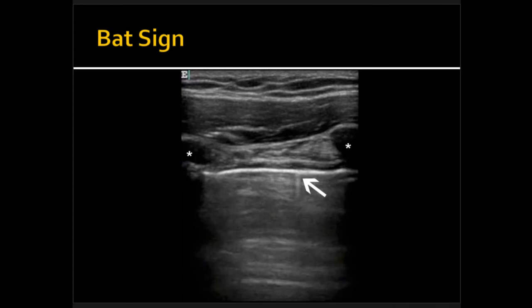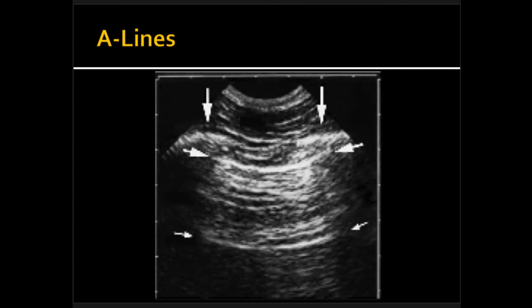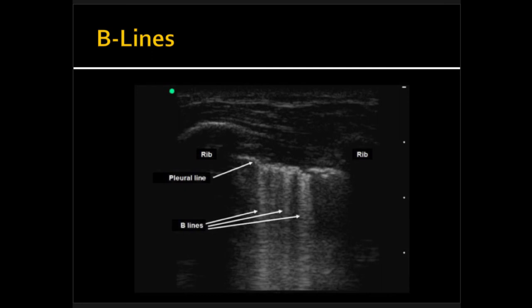The pleural line reflects A lines — those hyperechoic horizontal lines that show up below it. These are just reflections off the pleural line showing that your pleural surfaces are normal. There are also B lines — after A comes B. B lines are vertical hyperechoic lines that extend down to the bottom of the image, indicating subpleural interstitial edema. If you have a lot of B lines, you have suspicion for pulmonary edema. But importantly, B lines are indicative of good lung movement and no sign of pneumothorax where you're pointing your probe.